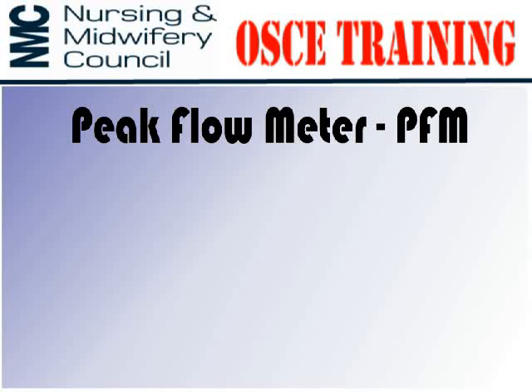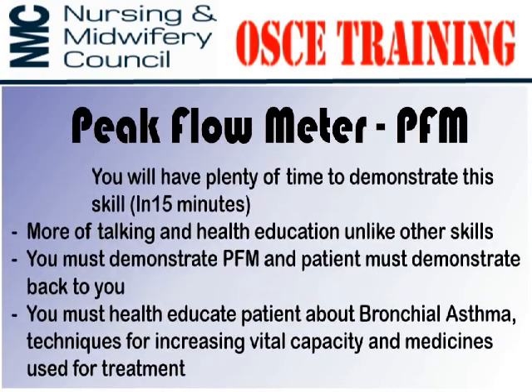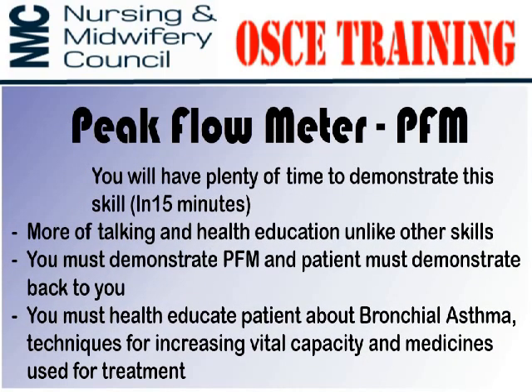In this video, we are going to discuss about peak flow meter or PFM. Let me tell you that you will have plenty of time to demonstrate this skill within 15 minutes. PFM as a skill includes more of talking and health education unlike other skills. You must demonstrate PFM and the patient must demonstrate back to you.